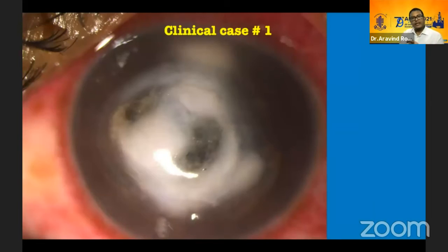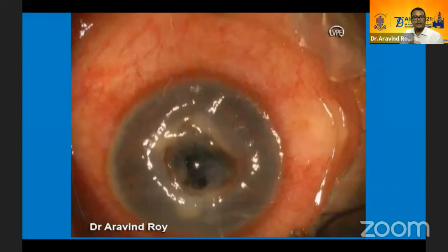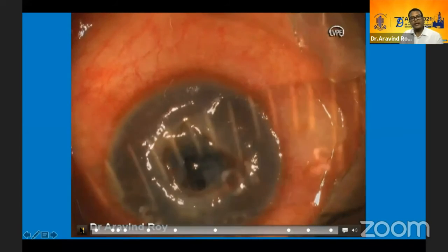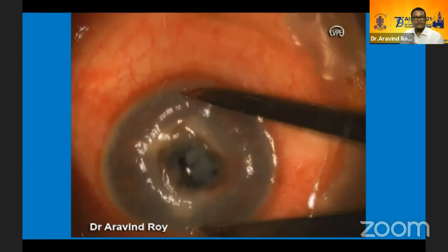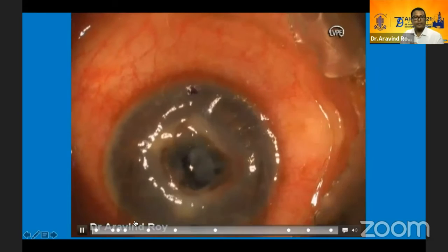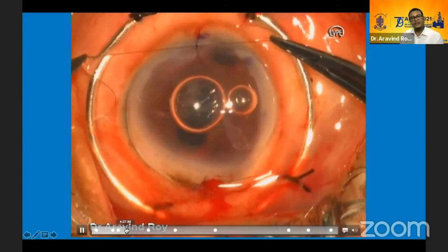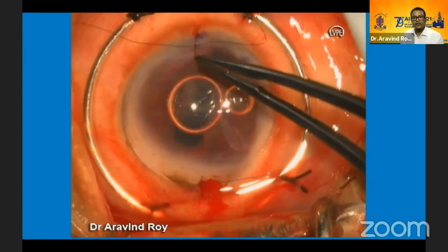This was a clinical case of a corneal melt which very rapidly progressed to a 6 millimeter central corneal perforation. A glycerol cornea was used because this case was performed during the pandemic and fresh tissue was not available. A freehand dissection was performed after marking the cornea, and once the trephination was done, the glycerol corneal tissue which had been thawed was used.